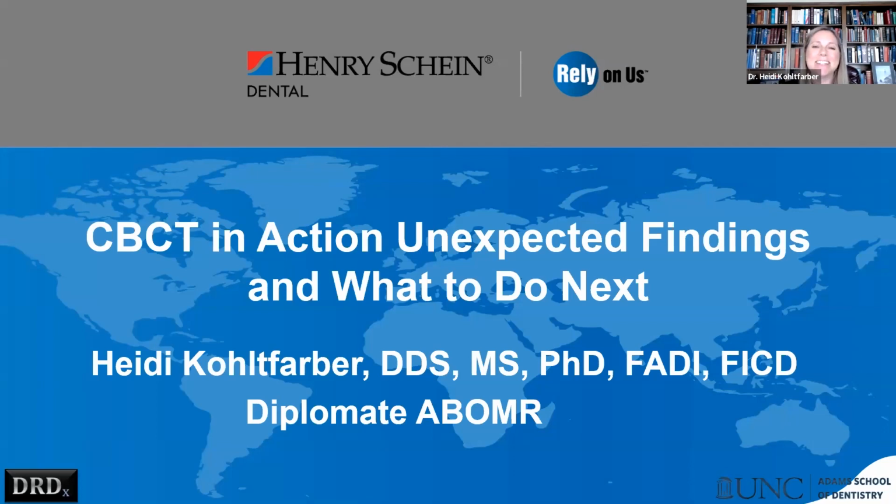Thank you. Today, we're talking about some unexpected findings that we might see in our CBCTs and what to do about them. I think it's really fun because, of course, there are common things we're going to see in our CBCTs, and we might be interested in understanding a little bit better what we should do with those. But there are those times that we see some very strange things. So I've put a lot of fun cases in here, some things that we've seen recently, and hopefully you will have a lot of fun with it. So thank you for spending your evening with me. And I think we're going to have a pretty fun time.